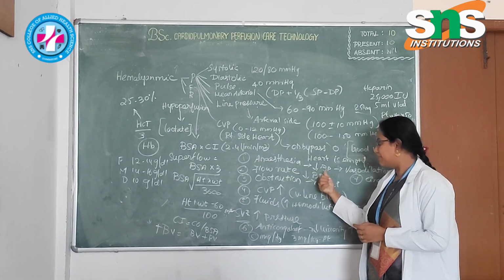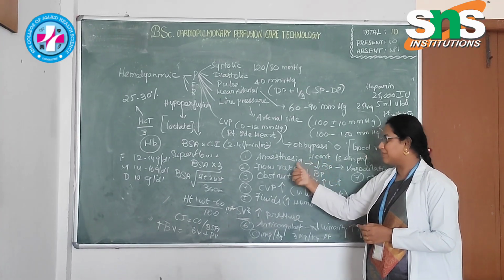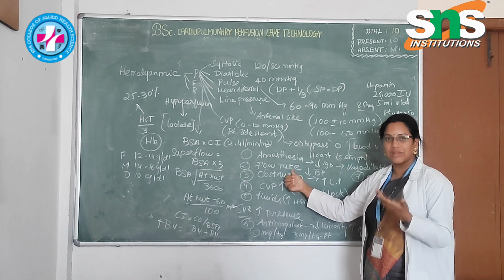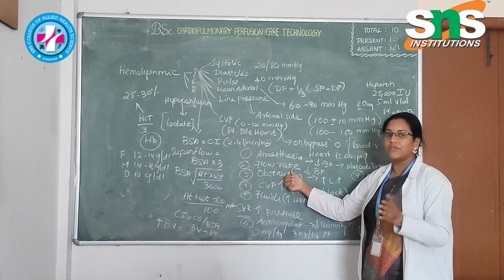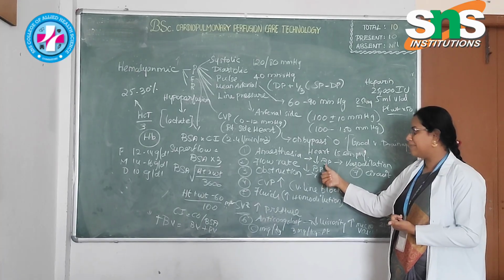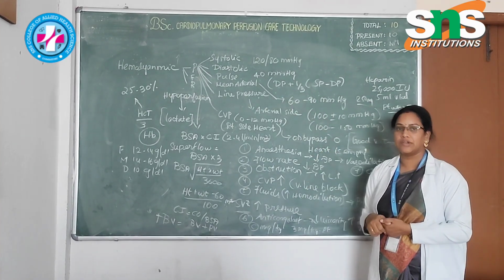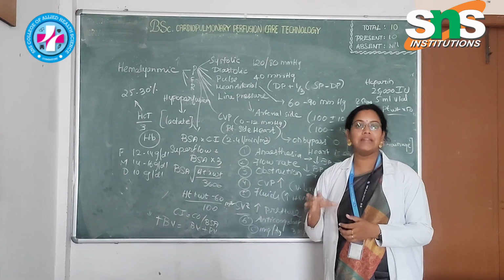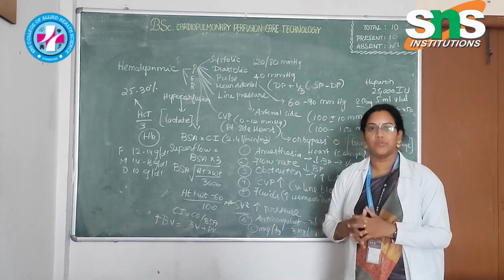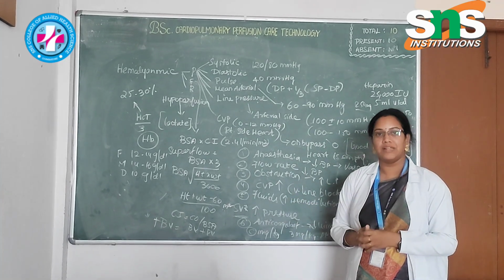So what happens to the BP while the flow rate is reduced? When the flow rate is reduced, automatically the BP gets altered. As an example, when you give a flow rate of 3 liters for a patient who needs 4 liters, automatically their BP gets dropped and their flow to the vital organs can also get dropped. Why? Because the autoregulatory mechanism which is happening in our body is not functioning during the surgeries. The autoregulatory mechanism is totally carried over by the heart-lung machine.